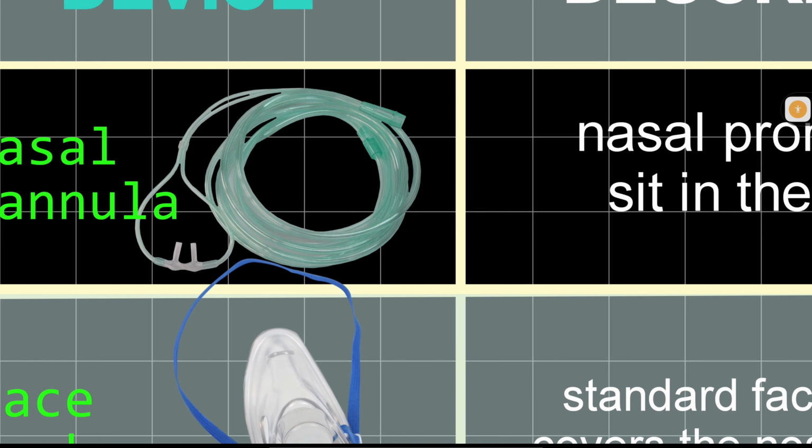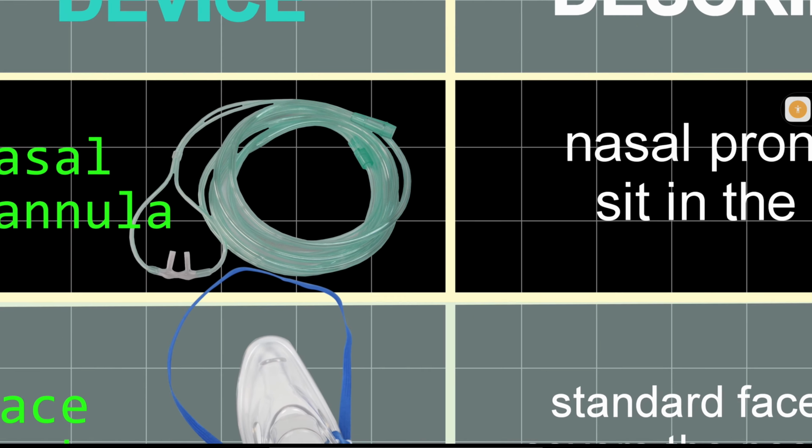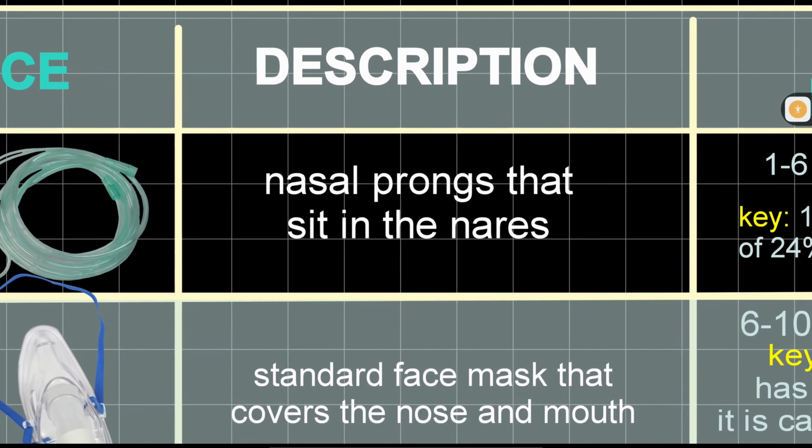It's basically the first step in giving oxygen to a patient or starting O2 therapy. First step and normally the last step. Whenever you try to wean off the patient, pababa ng pababa yung paggamit natin ng oxygen delivery devices natin. So the first one is nasal cannula.